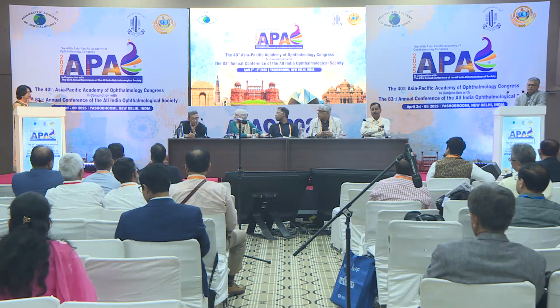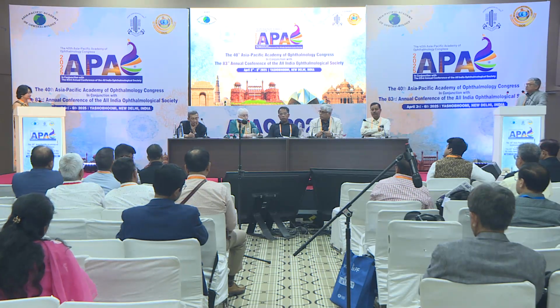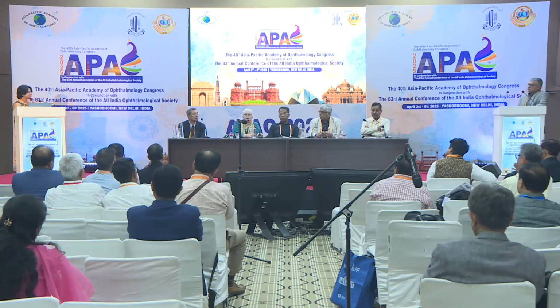Ma'am, since you talked about the retinal part, when would you advise a cataract surgery if you have done a retinal laser or retinal procedure after that? So there are two groups of patients. One where vitrectomy has already been done, silicone oil removal or gas removal has been done. These are already vitrectomized eyes.